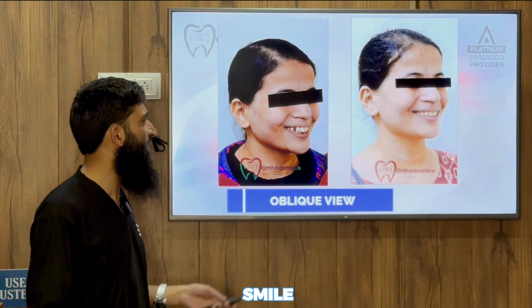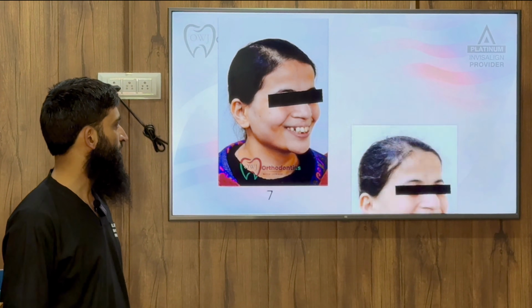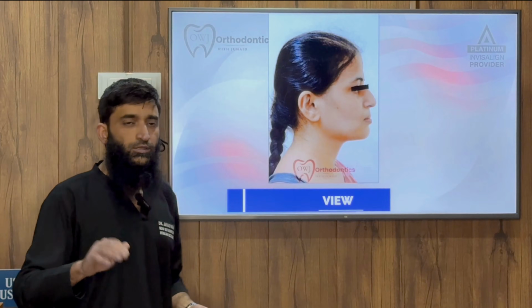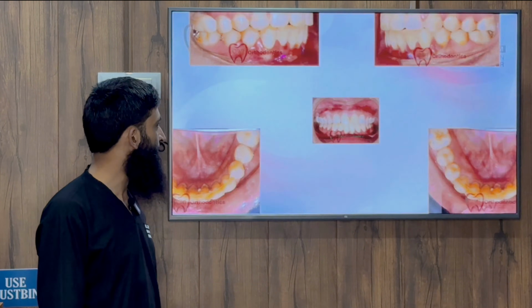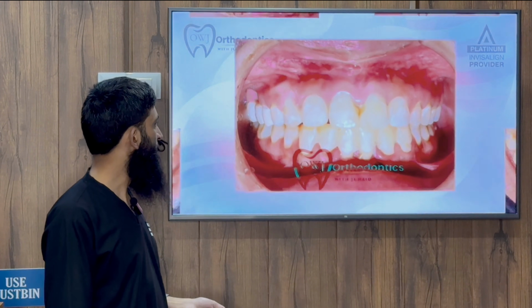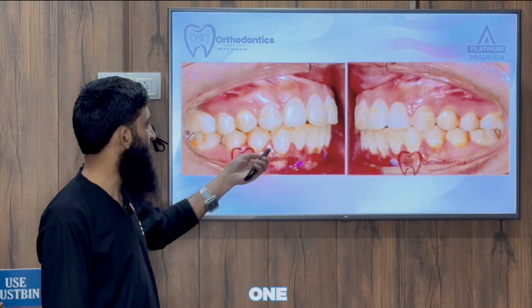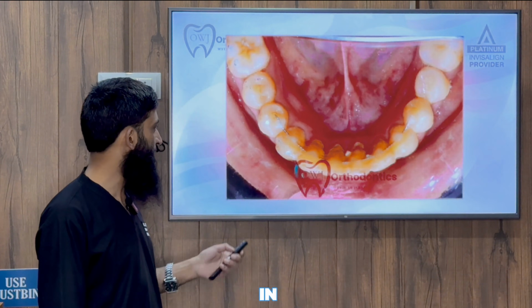This is the 3/4 smile. This is the oblique view, pre and post, and the profile view. So this is the profile. Now these are the intraoral photographs. Right buccal, left buccal, frontal, occlusal. Class 1 molar, class 1 canine, lingual retainers in place.